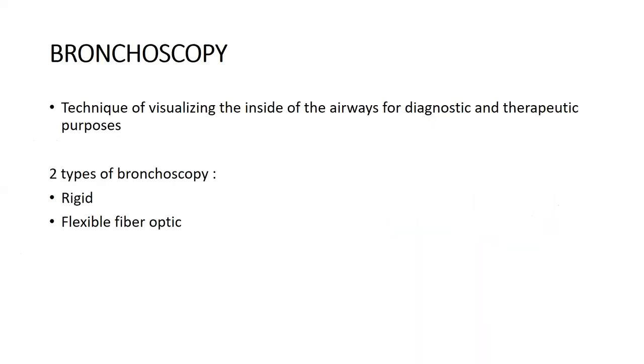Today I am going to discuss bronchoscopy. Bronchoscopy is an endoscopic technique which helps to visualize the inside of the airways for diagnostic and therapeutic purposes. Bronchoscopy is of two types. One is rigid bronchoscopy, the other one is flexible fiber optic bronchoscopy.